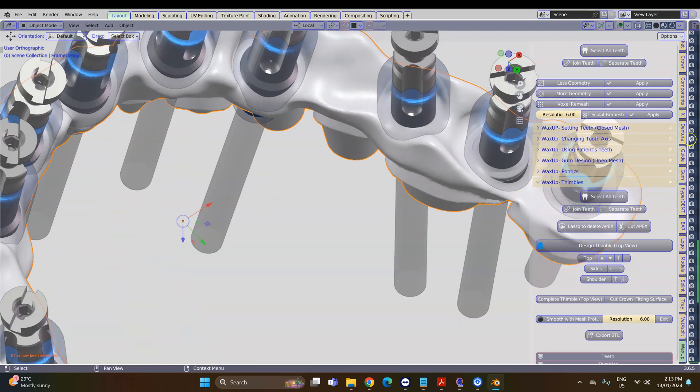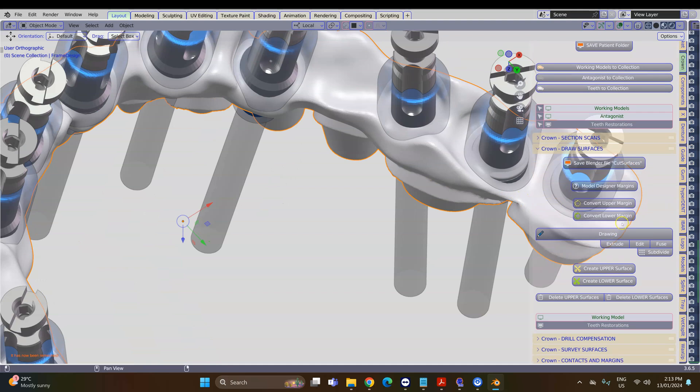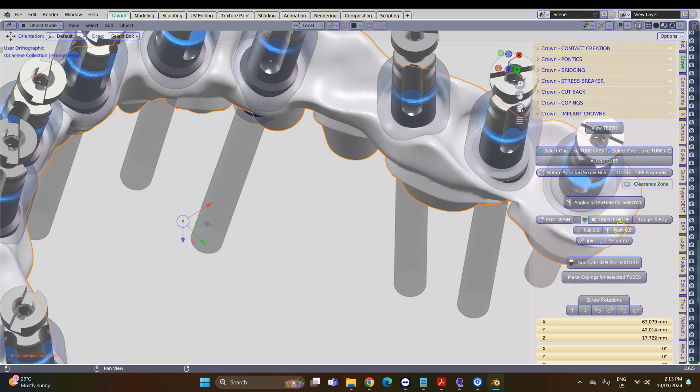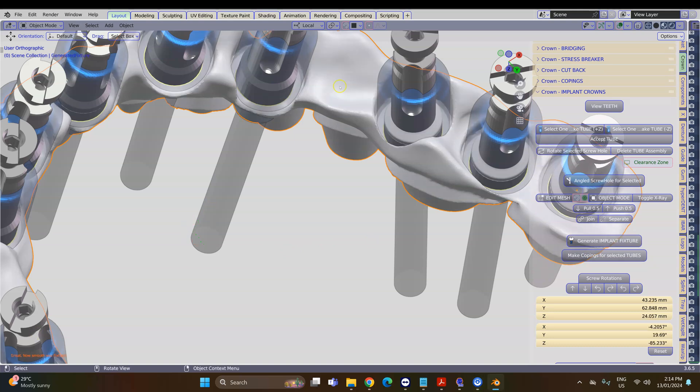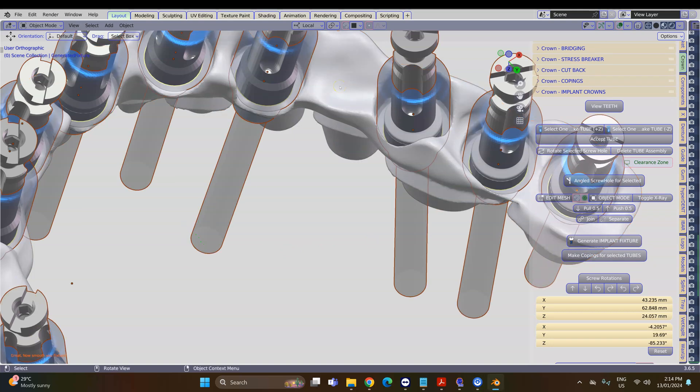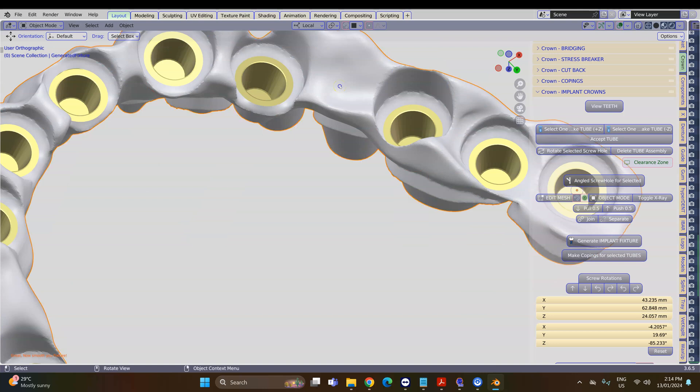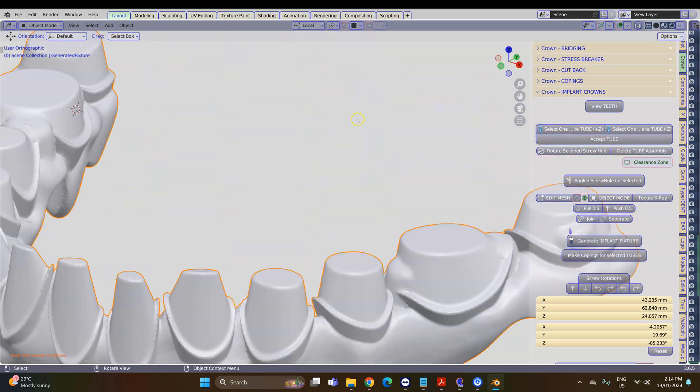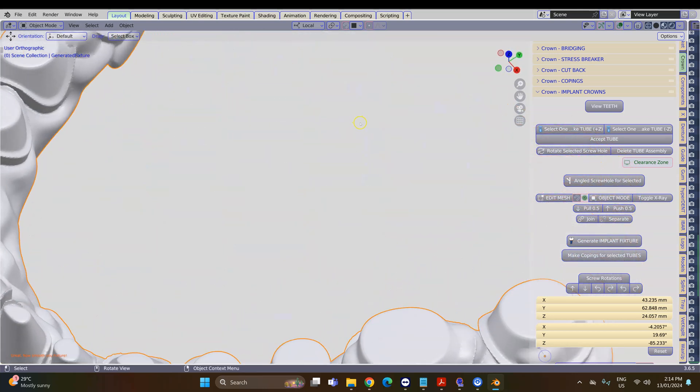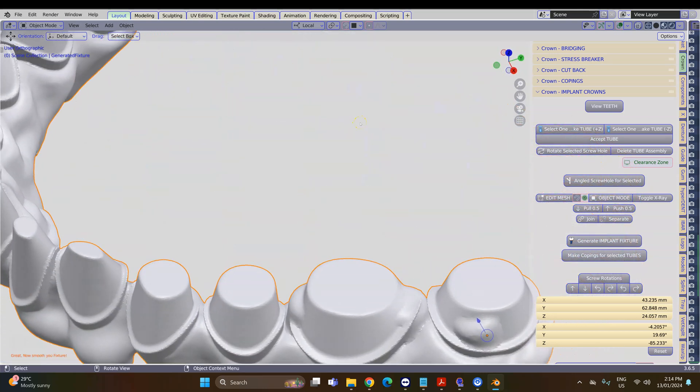I'm going to go back to the Crown module and we're going to hit the generate fixture key one more time. Please be patient. Then Ctrl+I and then H to hide, and that hole is now gone.